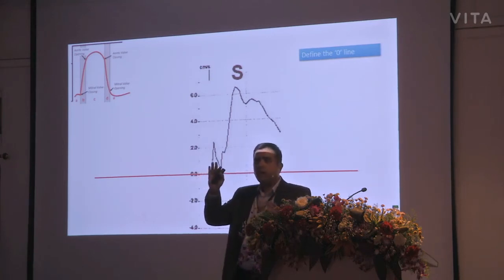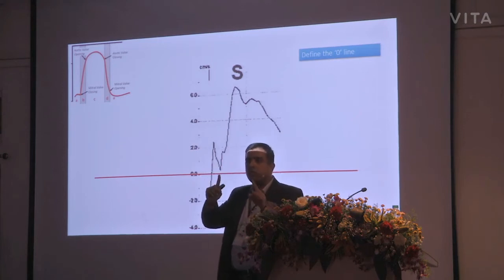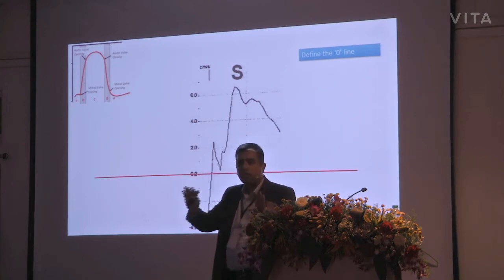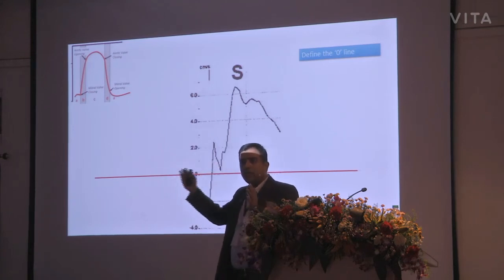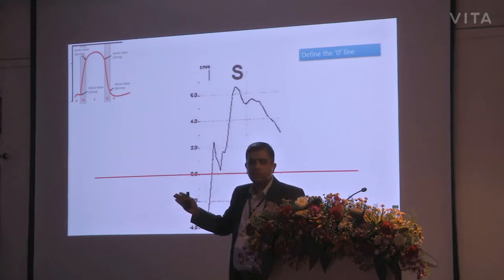Please note that everything I'm talking to you about right now is about your myocardial velocity curve only. Once we get a myocardial velocity curve right, that can very easily be interpreted into strain and strain rate, and the machine does that automatically.